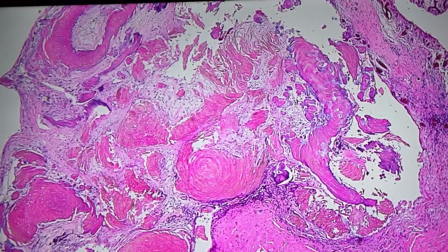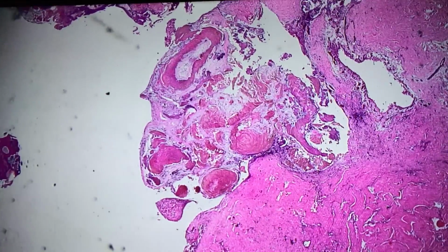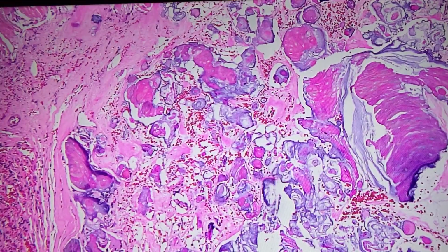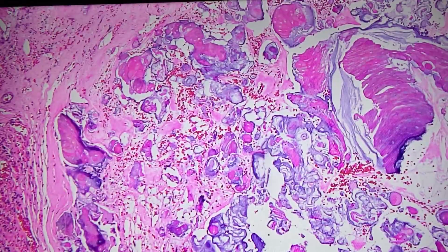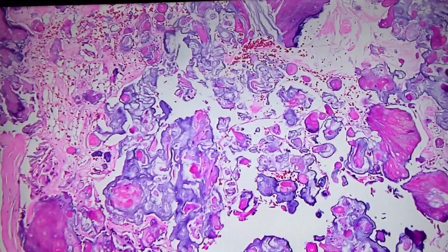This one. All right. Let me just back up a little. That's really the region. And it has this inside it. Yes, craniopharyngioma. Tell us the features quickly. This keratinization. Yeah, calcification and this kind of keratinization.